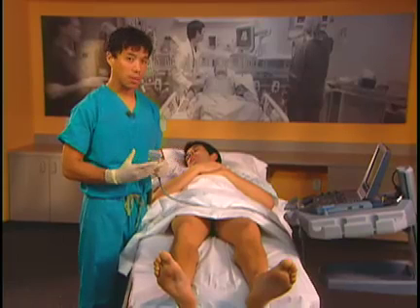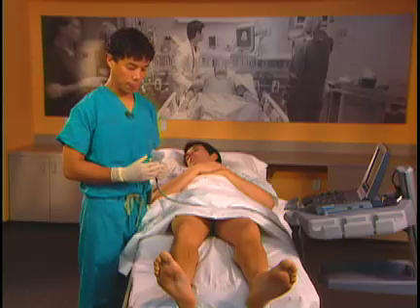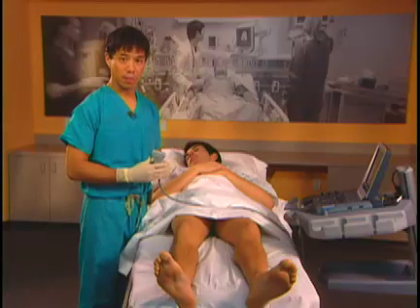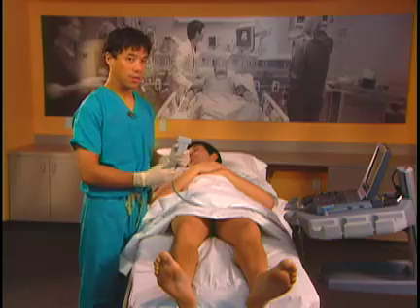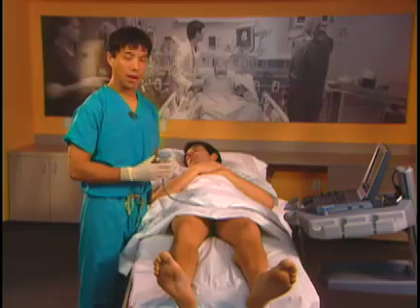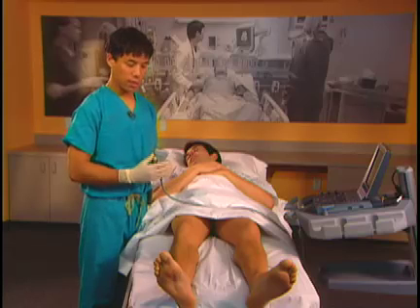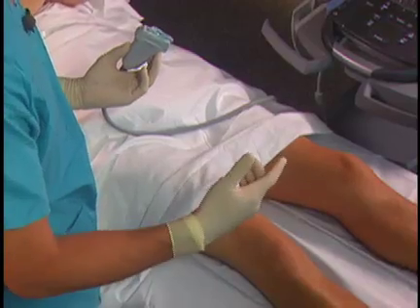The Saphenous Nerve is a small nerve and we may not see it in everybody — in fact, most people we don't see it in. The reason we do a Saphenous Nerve Block rather than a femoral block is that we don't take away any quadriceps muscles, so the patient will have no quadriceps muscle weakness. By doing a femoral block you will take out all your quadriceps. This technique is great for outpatient surgery because their quadriceps muscle strength will be intact.